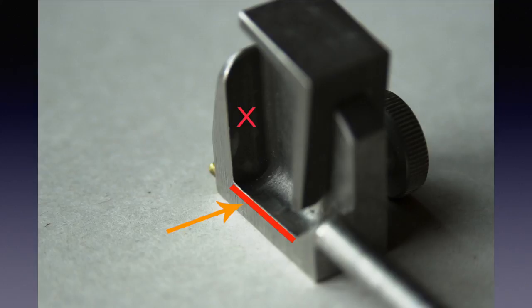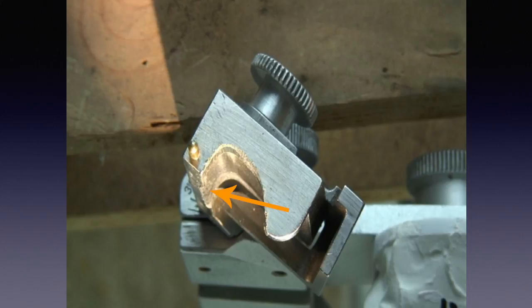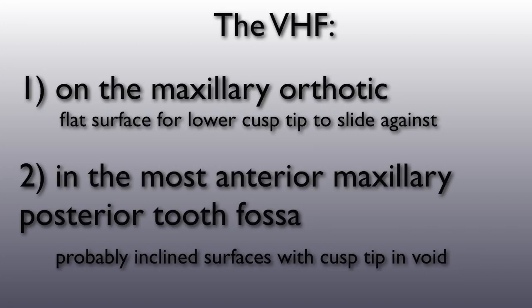In addition, the back wall of a Whip Mix is curved to accurately house the ball. That is a problem because if the patient's MI condylar position has a pure detrusion, that curved back wall will not allow the articulator to accept that condylar position. You have to cut the lip away in order to create a vertical flat back wall.